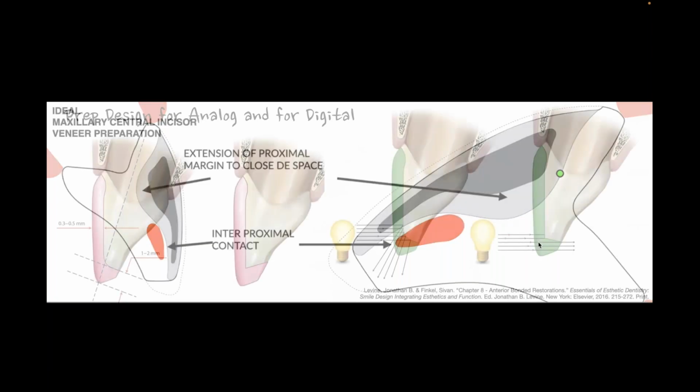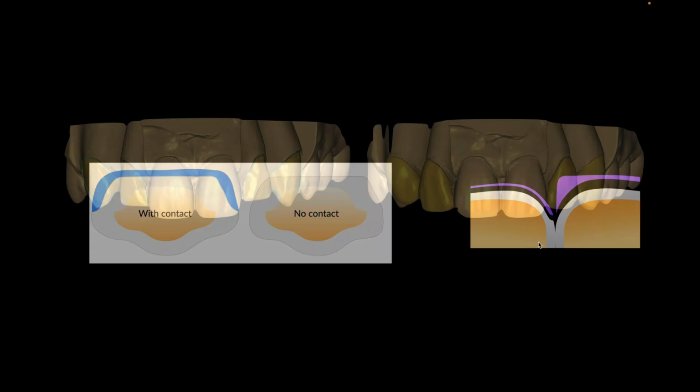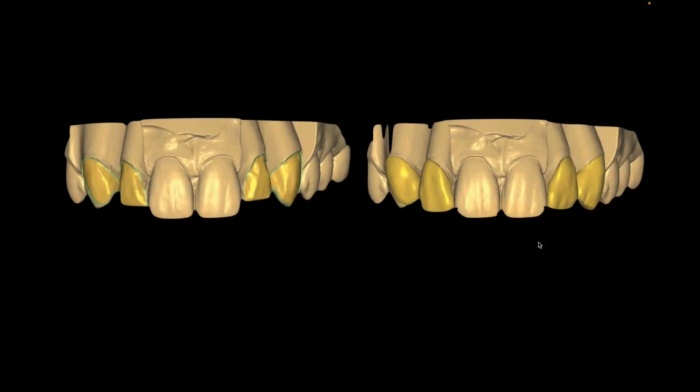So I'm not going to go into all the light and things, we've gone through this in layering before. What I really want to get to is all the different options that Jim tagged me with. So just to be clear again, because we have no broken contact and we're using minimally invasive preparations, this is really the reasoning behind not going with scanners for these types of impressions.